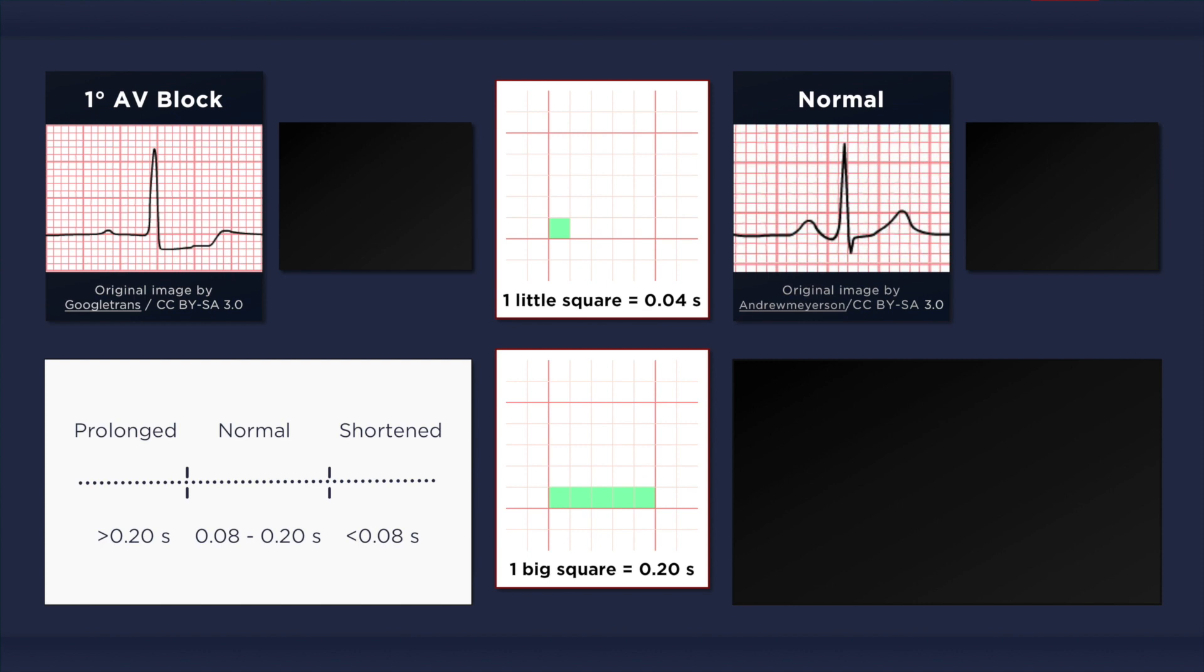With such extremely long PR intervals, the P waves can become obscured or hidden by the T waves. Now let's count the number of small squares within the PR interval in the normal ECG at the top right corner of the screen. There are about 4 little squares. That equates to 0.16 seconds, which is well within the normal limits.